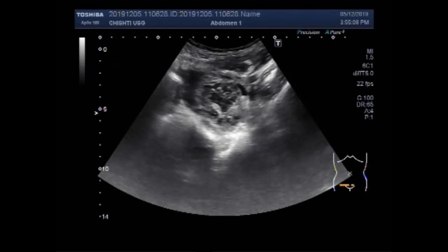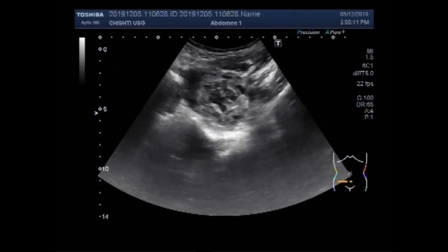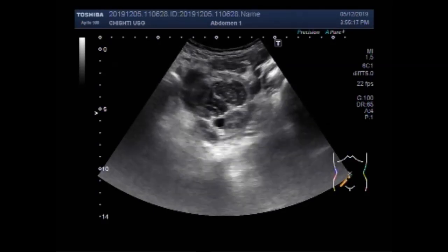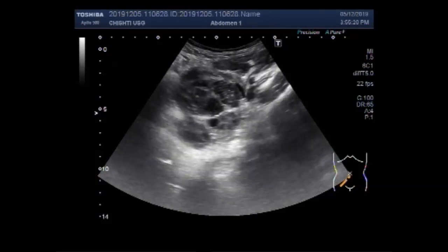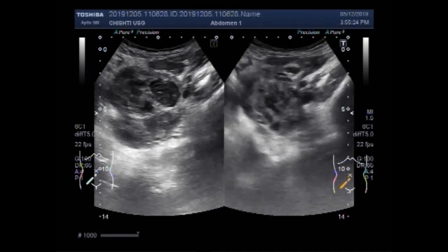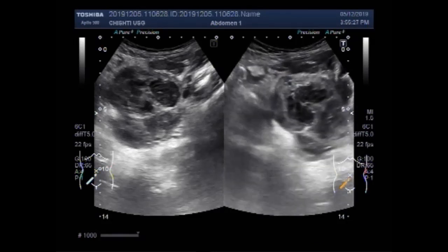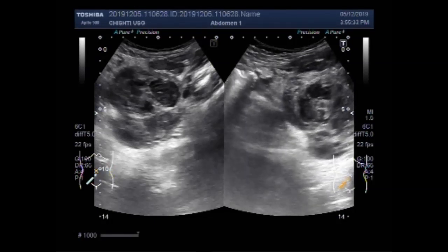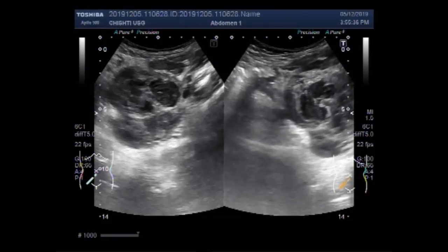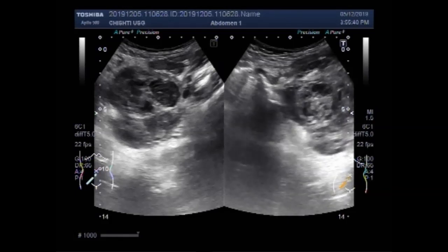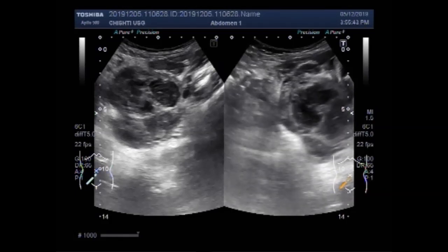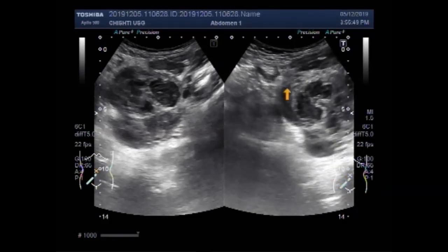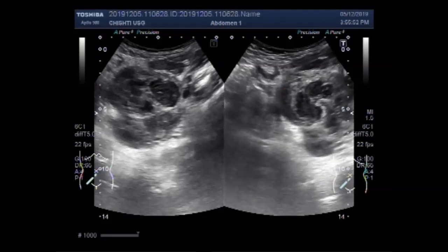Adhesions are also visible in between this mass and the uterus. Again you can see the ovarian mass, free fluid and the gut loops. Adhesions are visible in between this mass and the uterus.